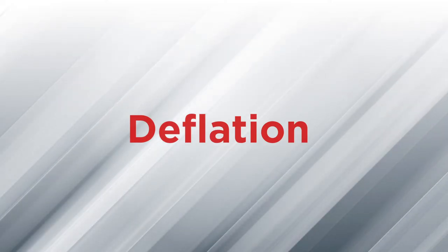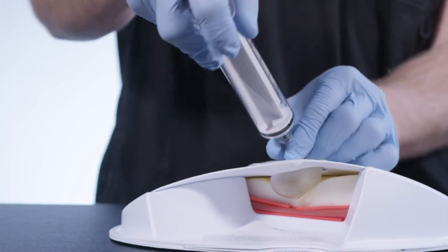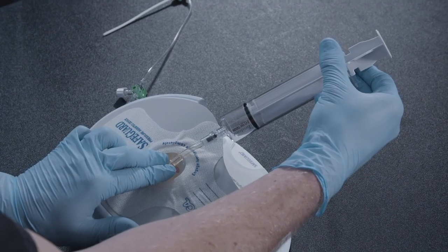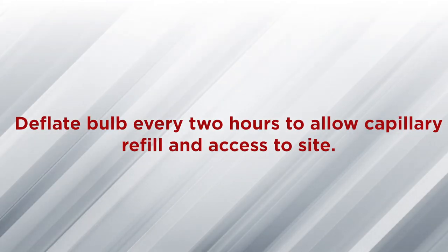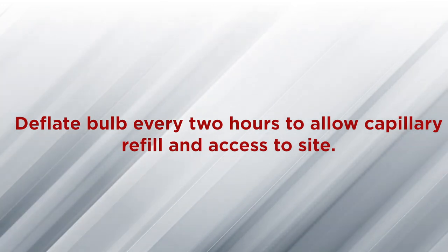The deflation process is the same for both post hemostasis and manual assist techniques. Deflate the bulb by attaching an appropriately sized luer lock syringe to the valve. Slowly depress the bulb allowing the syringe to fill with air. Observe the site for hemostasis. Reinflate the balloon if hemostasis is not achieved. Deflate the bulb every two hours to allow for capillary refill and to access the site. Reinflate the bulb if necessary.